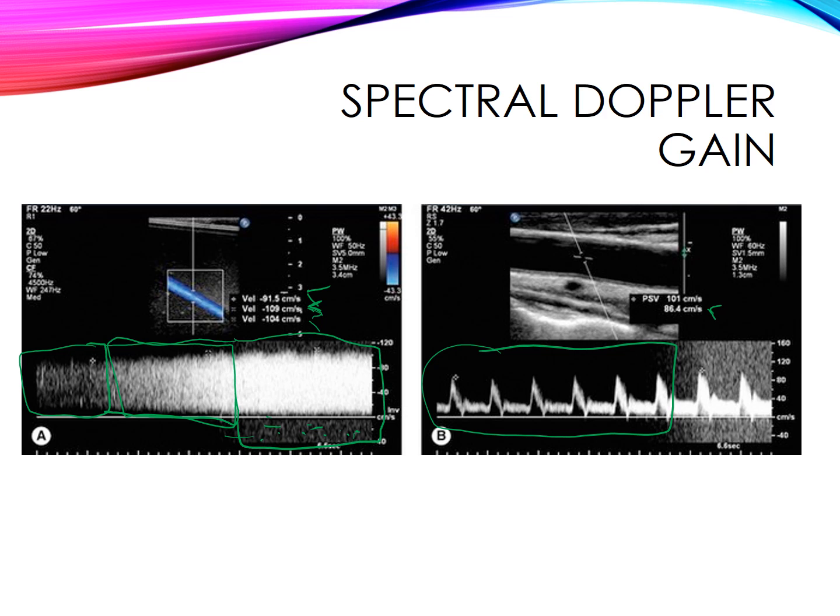As the sonographer cranked up the Doppler gain, we started getting all this little snow, these white marks behind, measured again, and they get 101 centimeters per second. That's a pretty big jump, and that might be enough to put somebody in between two categories of grading stenosis, or plaque measurements, or regurgitation. It might just be enough to tip them into another category. So we have to be really careful that we're setting these appropriately.